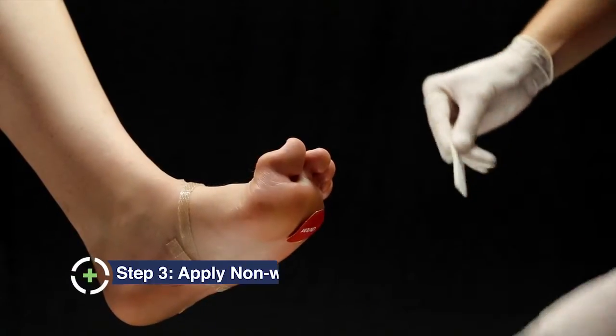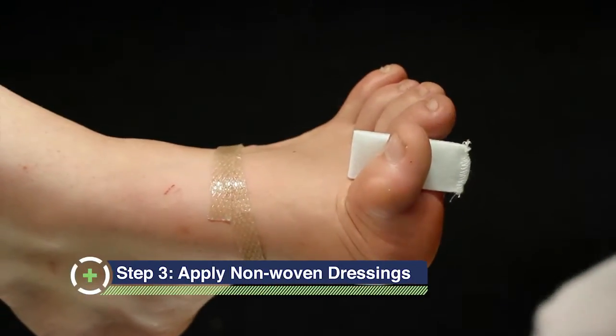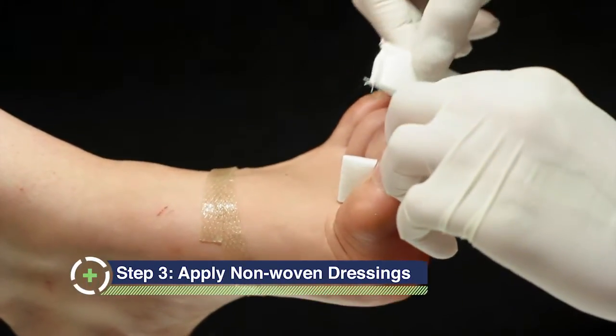Remove the four small rectangular pieces of non-woven dressing from the packaging. Place one piece in between each toe.